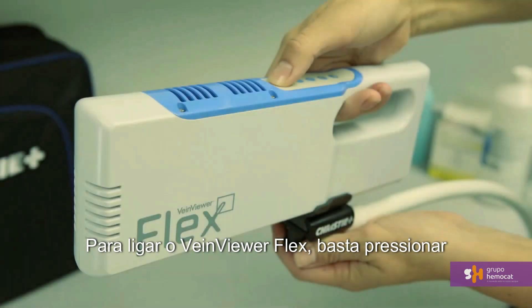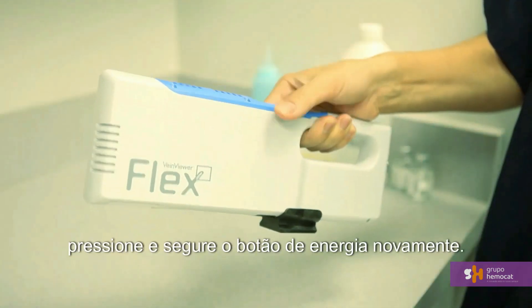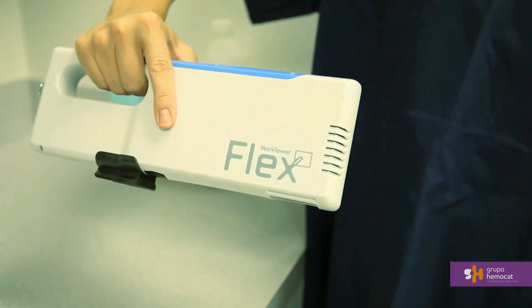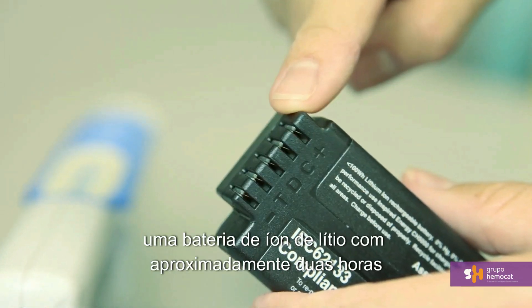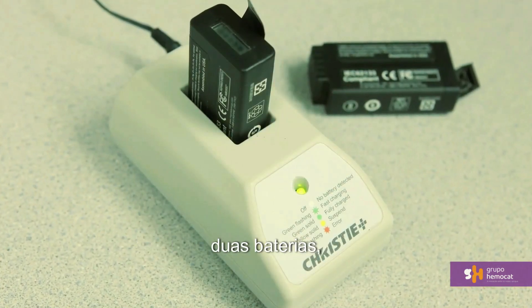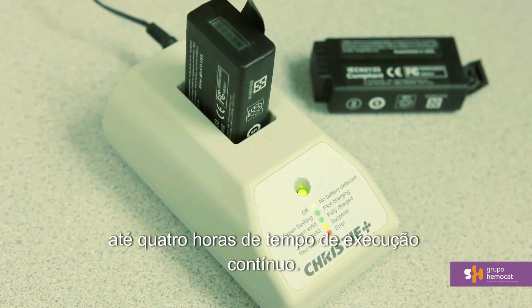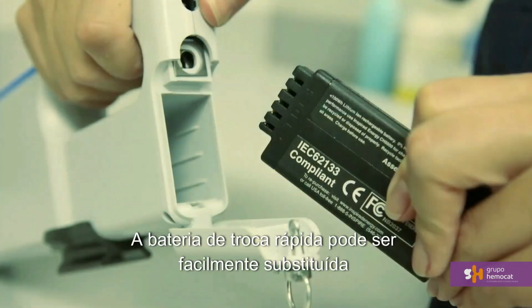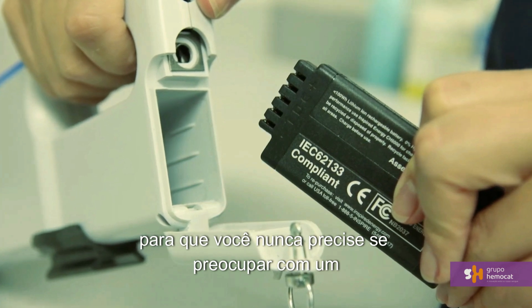To power VeinViewer Flex, simply press and hold the power button for about a second. To power down, press and hold the power button again. Flex operates via a lithium-ion battery with approximately 2 hours of continuous run time. Your base accessory kit includes two batteries, and with both charged, you will have up to 4 hours of continuous run time. The fast swap battery can be quickly switched out so that you never have to worry about a dead device.